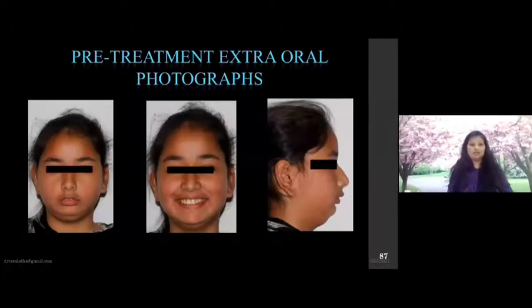This is a pre-treatment photograph of a patient named Vishwachi. She came with a complaint of forwardly placed upper incisor. That is what her chief complaint was, and she was unable to close her mouth. When I checked the extraoral frontal examination, we can see incompetency of lip, everted lower lip, double chin, perioral musculature hyperactivity.